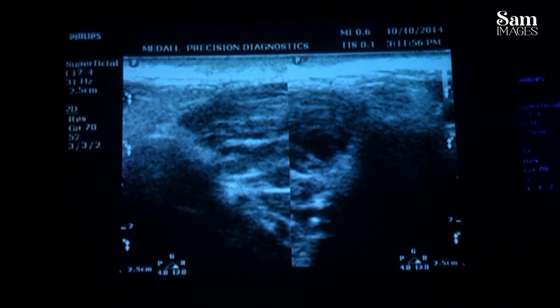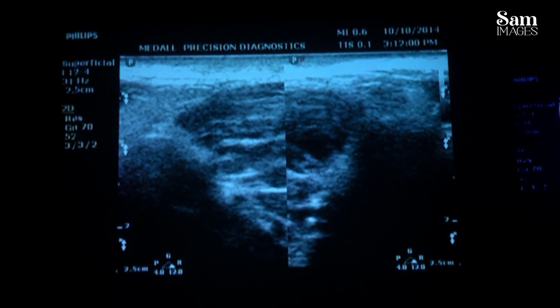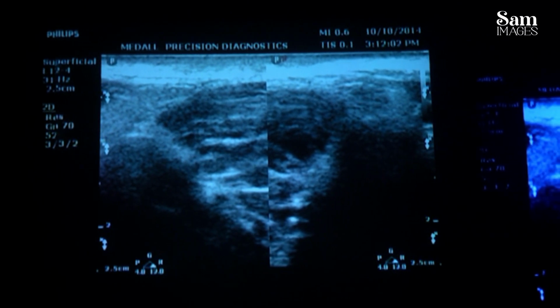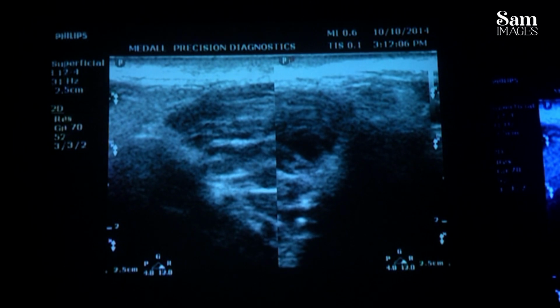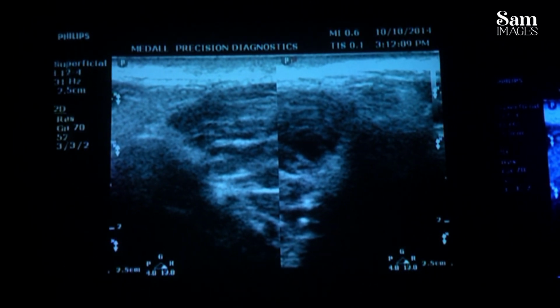I'm going to demonstrate the pathological ones, 2 cases. At that time I will show you what you have to see: the smoothness of the condyle and the articular disc, which has to be hypoechoic. That's all. These 2 things you have to follow. Thanks.